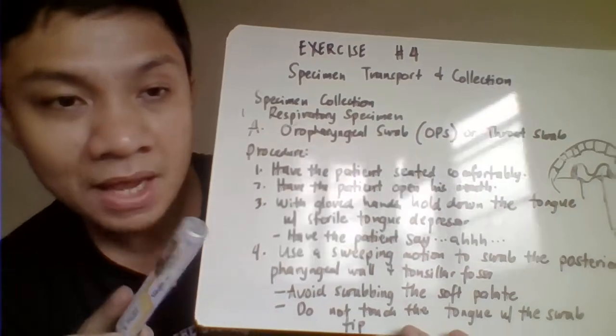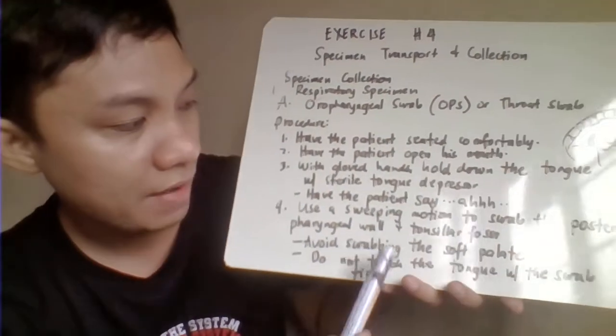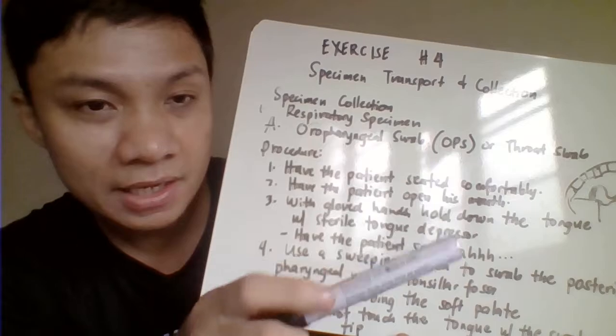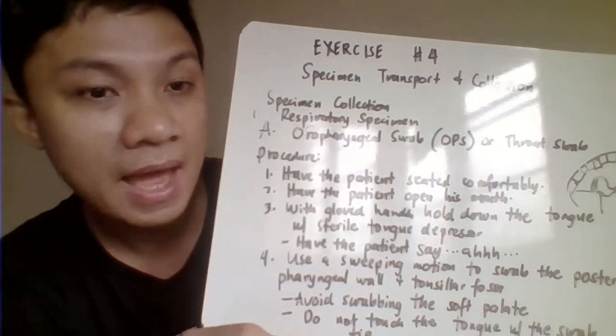Make sure that our swab does not touch the tongue of the patient or even the soft palate. Once you reach the area, just rotate the swab. Swab, swab, swab on that side.